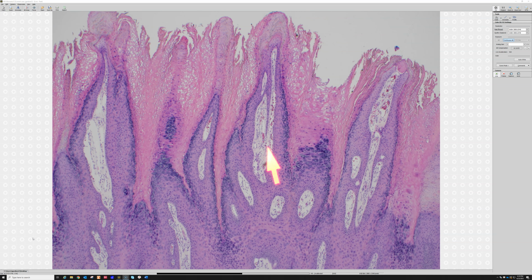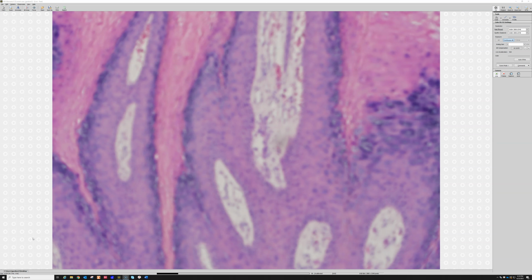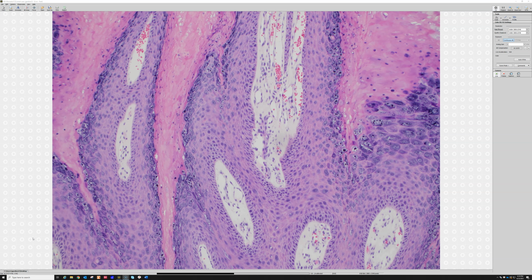Of course, it has to have a blood supply because epidermis doesn't have any blood vessels in it, right? The blood vessels always come from the dermis underneath. Okay, so the dermis has to be present here. Otherwise, these tall finger-shaped projections wouldn't have any blood supply and oxygenation, and they'd die. So the dermis here inside the papillae has really prominent dilated blood vessels. That's another useful finding if I'm debating about if something's a wart.